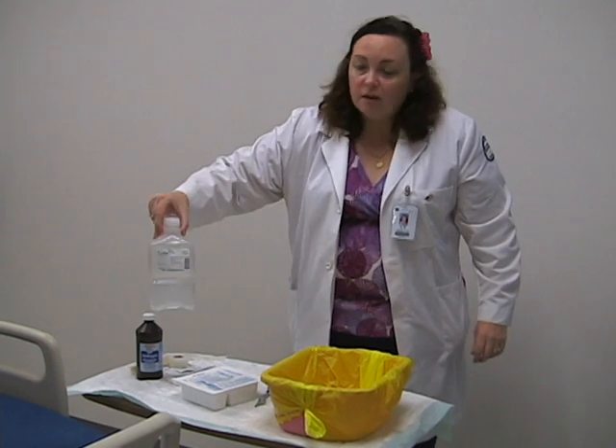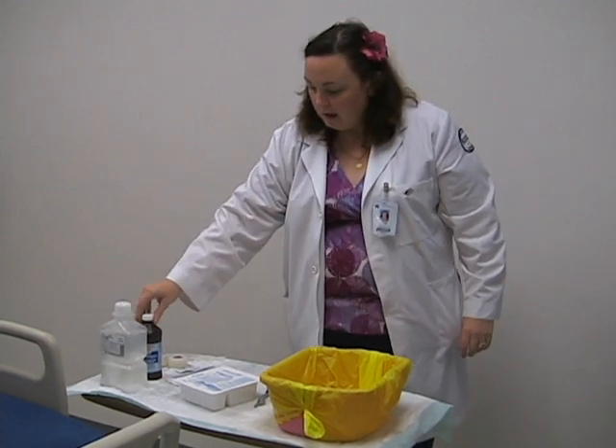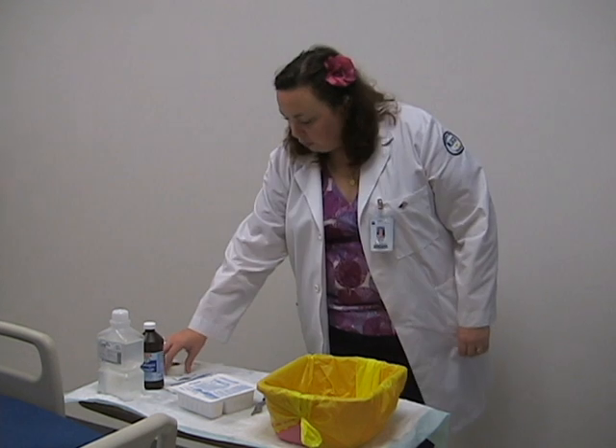We have some sterile saline and some hydrogen peroxide. Please refer to your policy and procedure manual and also the physician's orders for the tracheostomy care. Some cannulas do not do well with peroxide — they do degrade — so you need to double check and make sure that that is within their policy. We also need extra gauze just in case.